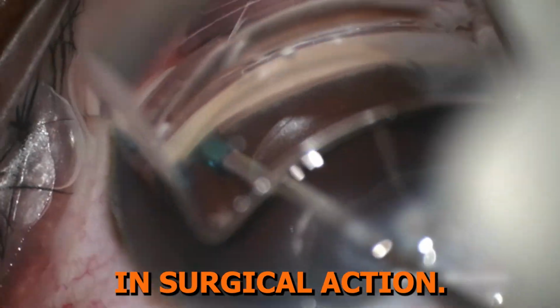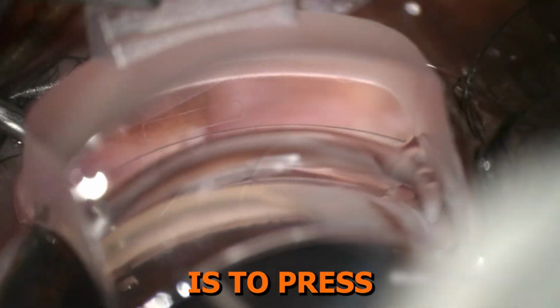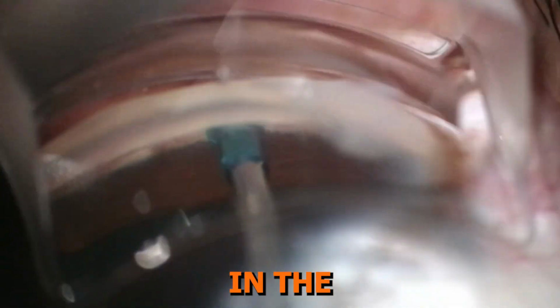Here is the Streamline in surgical action. After insertion of the device, the blue outer sleeve is pressed against the pigmented TM, and then the button is depressed to retract the outer sleeve and deliver the inner cannula that pierces the TM and delivers viscoelastic. This is repeated up to 8 times, typically in the nasal quadrant.